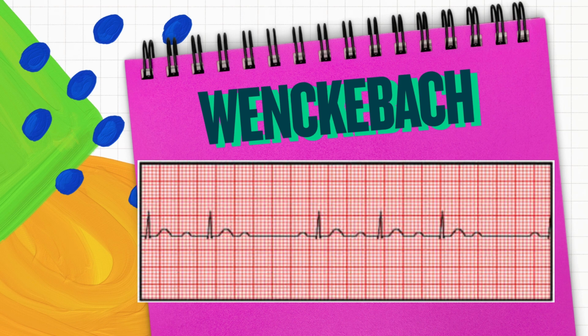Okay, here we have the EKG for Wenckebach. As you see, from the third complex, we have the PR interval gradually increasing. Then, after 3 QRS complexes, we have a P wave without the QRS complex.